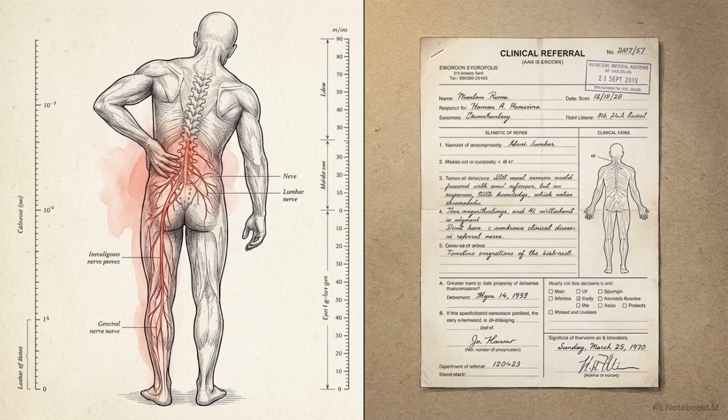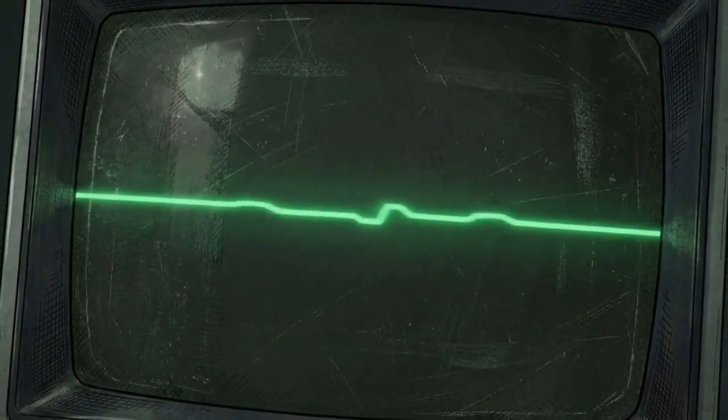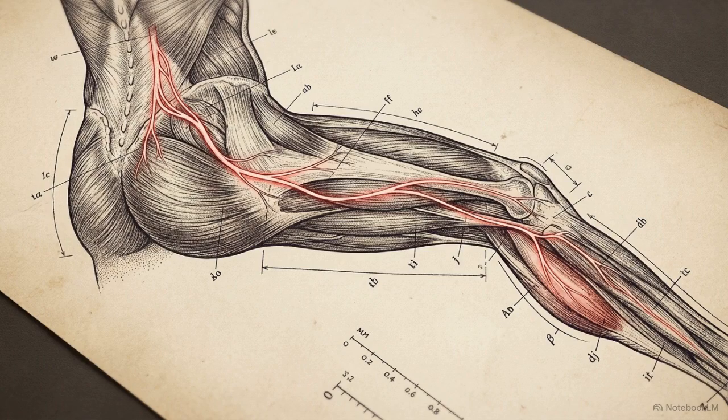Nearly 50% of patients referred to an electrodiagnostic laboratory for a clinically suspected radiculopathy return a completely normal study. Here we see the typical finding, an entirely normal sural sensory nerve action potential, or SNAP. Despite this high rate of negative test returns, these patients are usually experiencing genuine pathology. Their primary complaints are dominated by radiating sensory symptoms and pain.